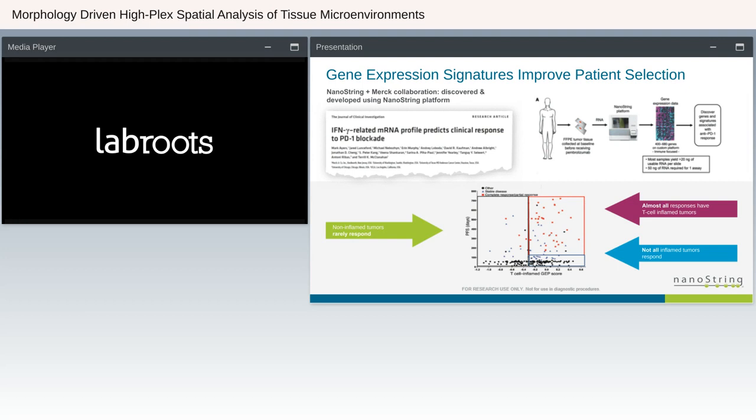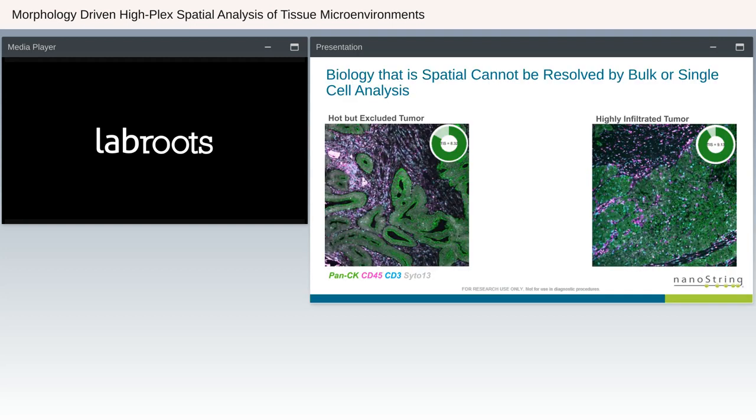And so, when thinking about tumor biology and why maybe a bulk expression signature on its own is not enough, we have to really understand how the tumor works, and how these checkpoint therapies work. When you've got an inhibitor therapy that's removing the brakes from your immune system to go in and fight the tumor itself, you need to make sure that that tumor is primed. And that inflammatory signature gives you a good understanding of what the presence of those immune cells are within or around the tumor.